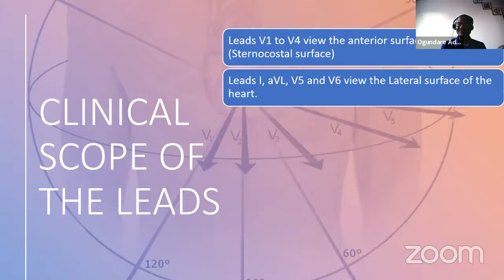Okay, so when you have lead 1, AVL, V5, and V6, these are the lateral leads. There are 4 of them: lead 1, AVL, V5, and V6. If you were with me when I was talking about the electrodes, you will agree that V5 and V6 are more lateral.